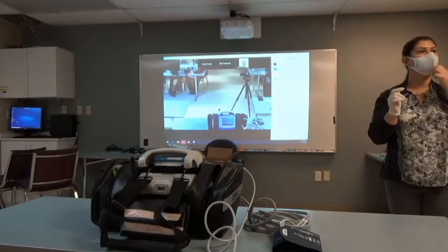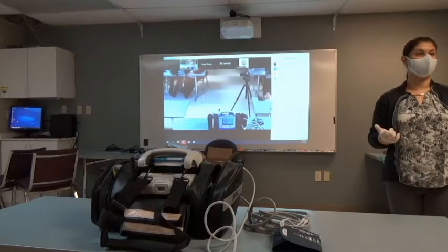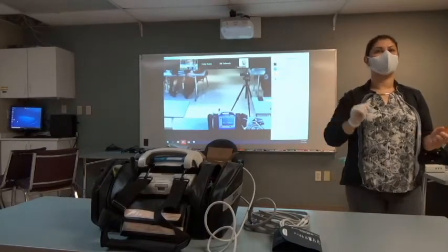How do we get into AED mode? Analyze. Okay, here's the important part. How do we get out of AED mode? You can either hit the exit button or your energy select button down.